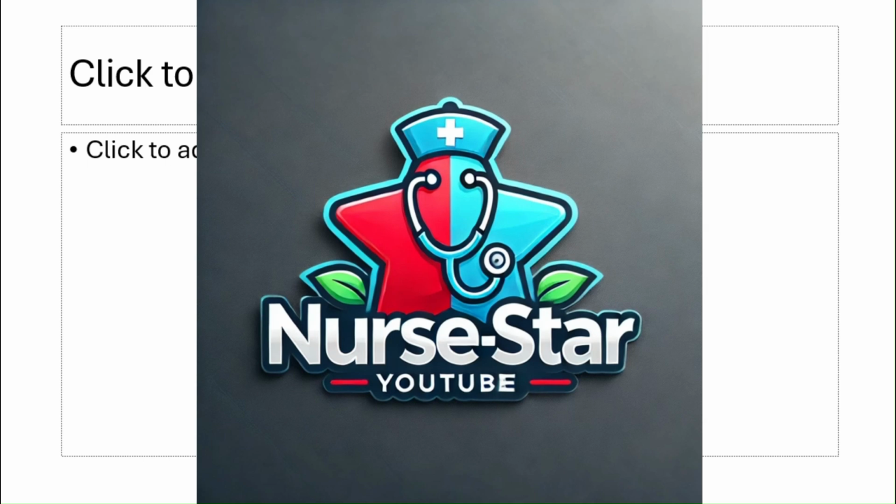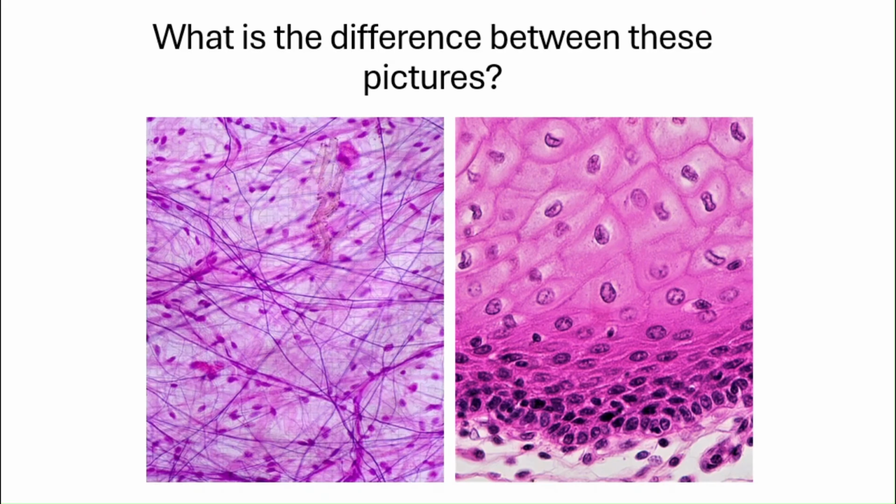Today we are going to speak about connective tissue. What is the difference between this slide and that one? As you can see, on the right one here, the cells are packed together, but here at the left, the cells are scattered among some straight protein fiber. This one is called connective tissue, but this one is epithelial tissue that was spoken about in the previous video.